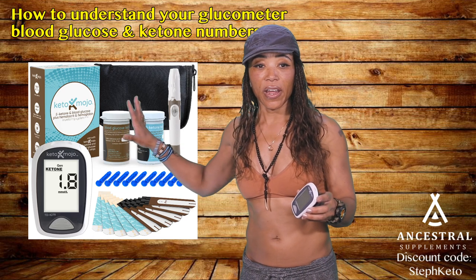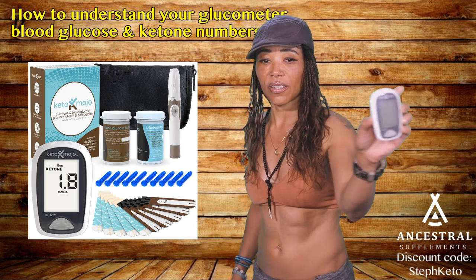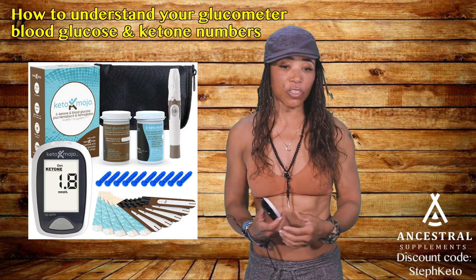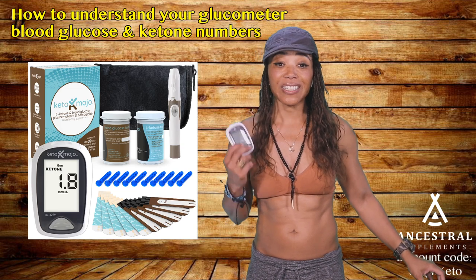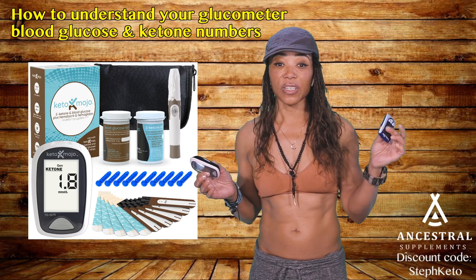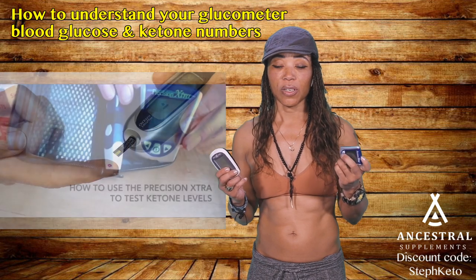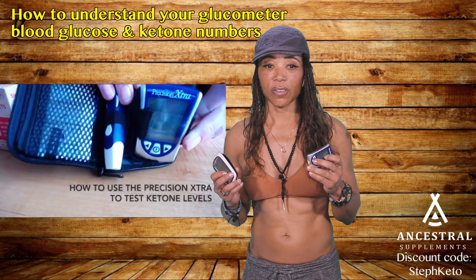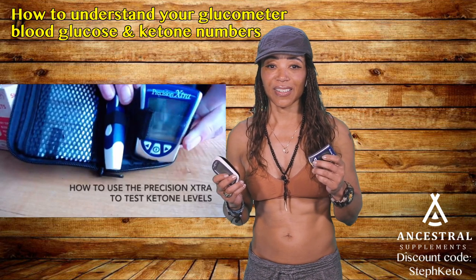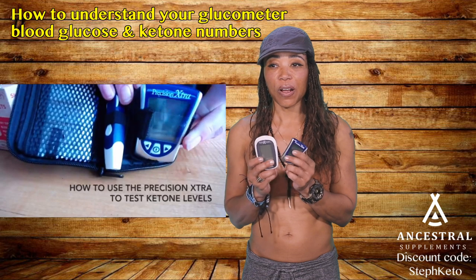The other one is the Keto Mojo system. Now, the Mojo is cheaper — the ketone strips are cheaper, which is where they really get you with the Precision Extra. The glucose strips on both are pretty cheap.